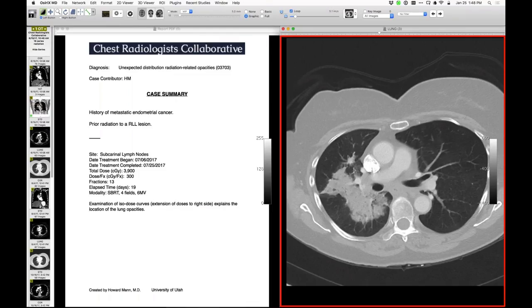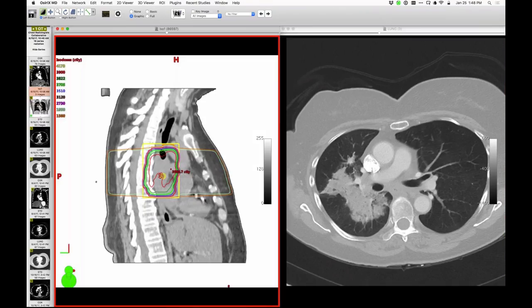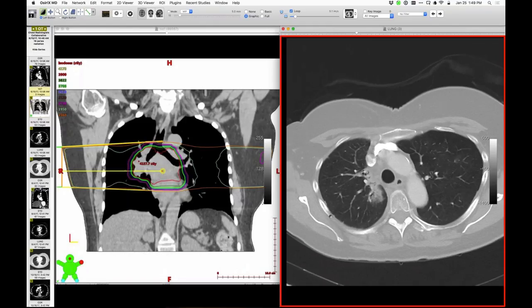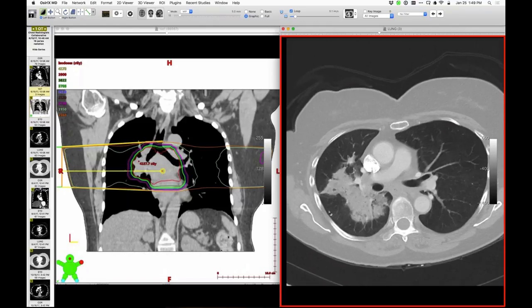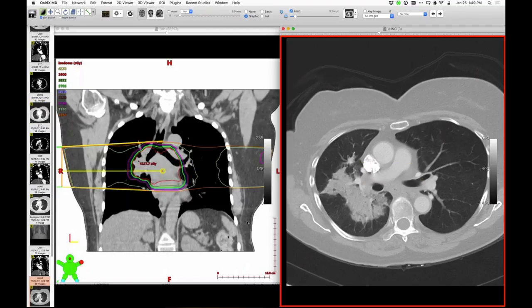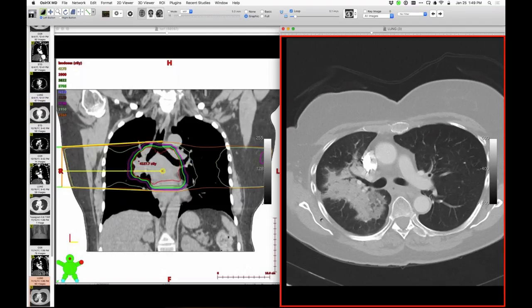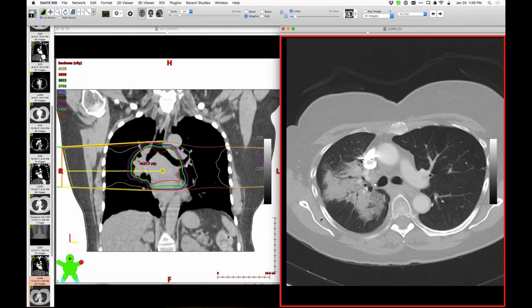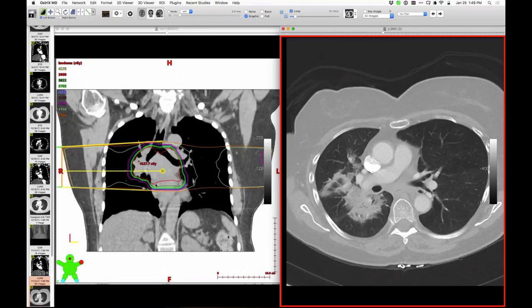I asked radiation oncology to give me the isodose curves. Looking at the axial section, they did radiate more of the right parahilar lung and right upper lung. The asymmetric opacity corresponds to the asymmetric cumulative dose — more radiation to the right side. After speaking with the radiation oncologist and correlating the isodose curves, we were confident this is radiation-associated disease with no other reasonable explanation.